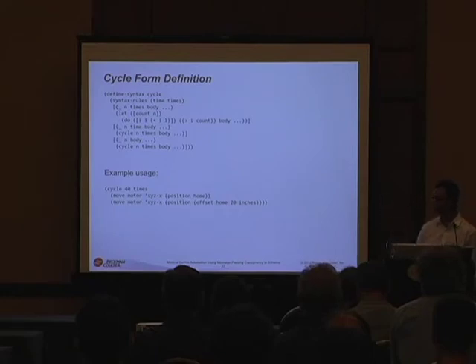It's the cycle abstraction macro, and you can see it's just basically a do loop. That's all it's doing. It's matching. It takes in auxiliary keywords like time and times. So one, we make the DSL squishy so that somebody like a scientist is trying to write this.